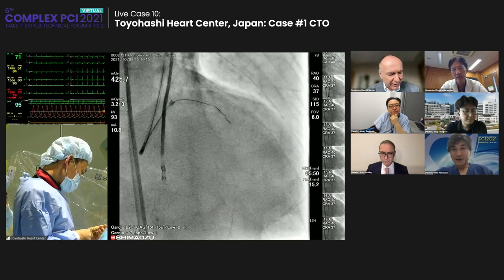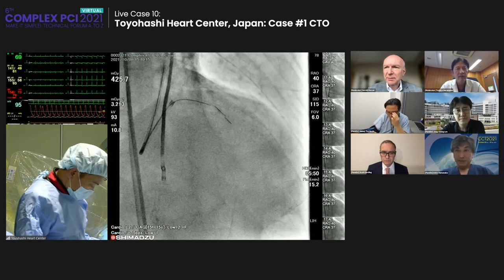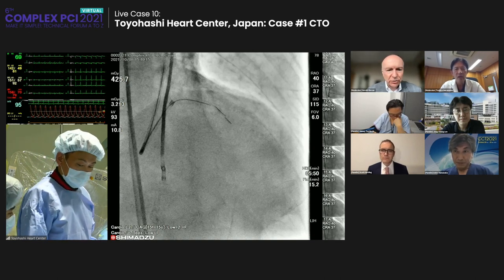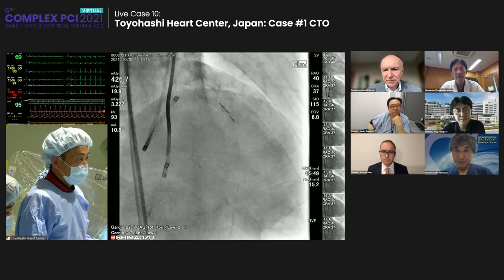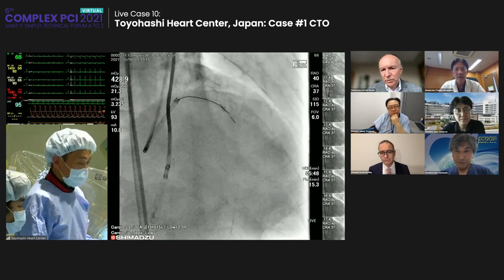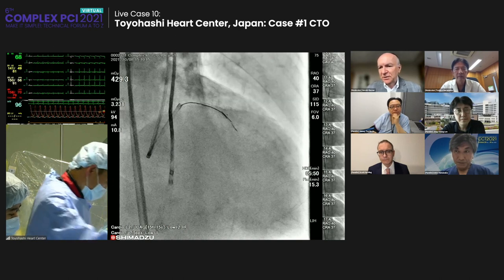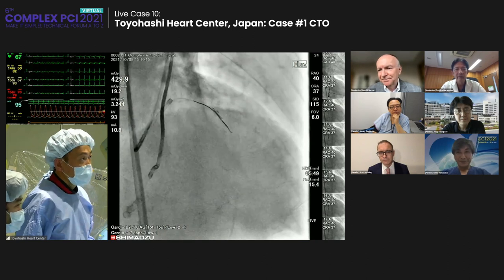Let me ask the panelists about their experience in stent occlusion and the prevalence. I have the idea from recent years that we believed stent occlusions were becoming less and less, but as I mentioned with my two cases this week, I think we come into an era where we have a different kind of stent occlusion, and it's still in the range of 10-15% of our cases. What is the experience in Japan and Down Under?